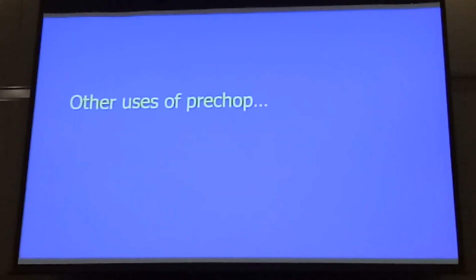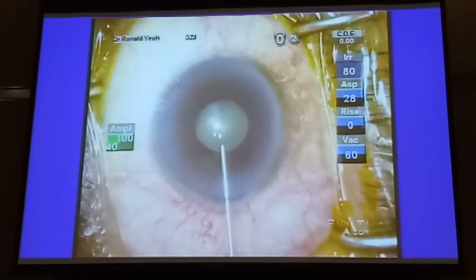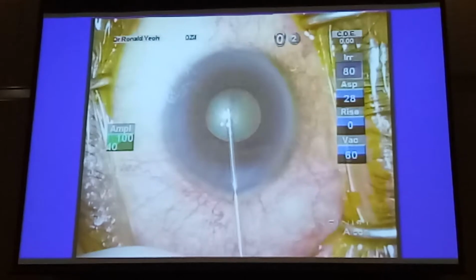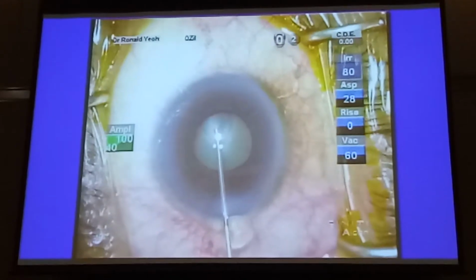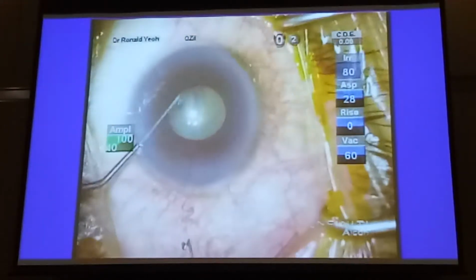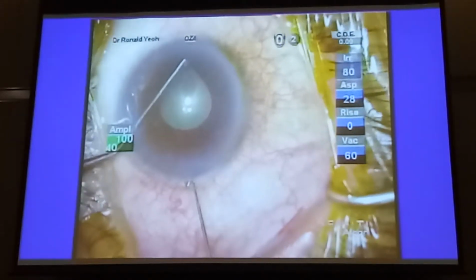Now there are other uses of pre-chop. What happens if you've got a small pupil like this? When you've got a small pupil like this, it's going to be hard to groove because you can't get a long enough groove to crack. So this is one of those situations in which I think that the pre-chopping is actually quite a useful technique. But even for this, I think it's not a bad idea to stretch the pupil.